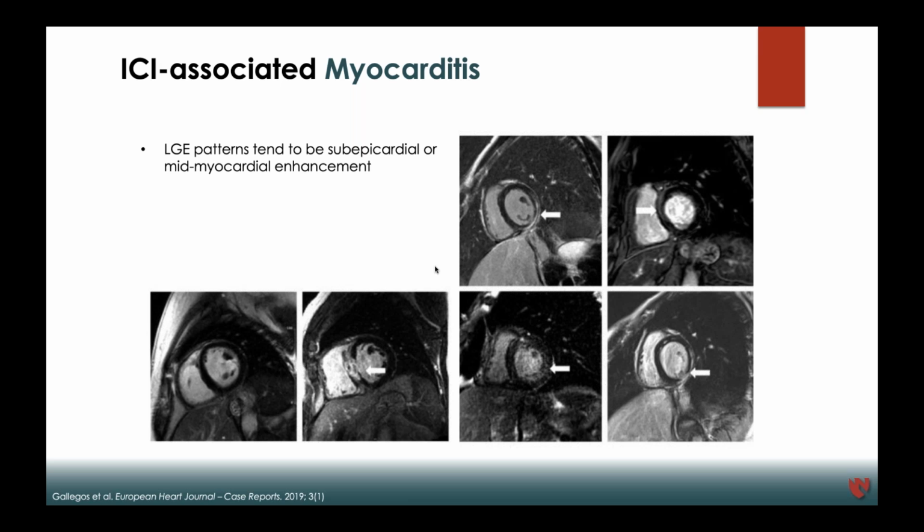So I don't think we'd see LGE completely resolved, but in myocarditis in general, we do see resolution of T2 abnormalities after they get their treatment or their disease process resolves, because that active inflammation is gone. So at least we can use MRI to distinguish between active inflammation versus no inflammation, and the LGE can tell us if there has been myocarditis present or not. So does that answer your question?